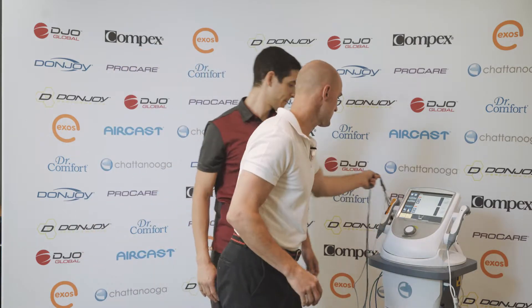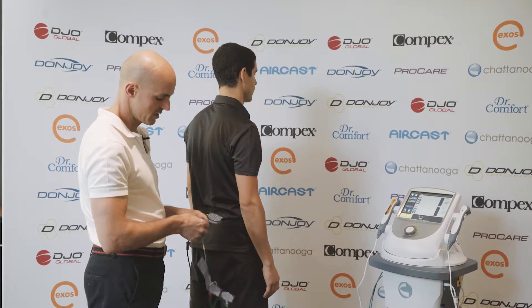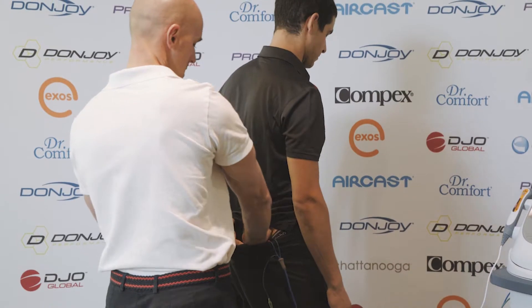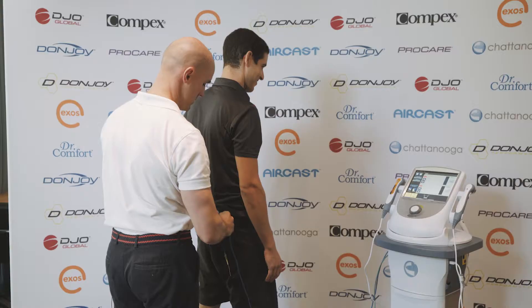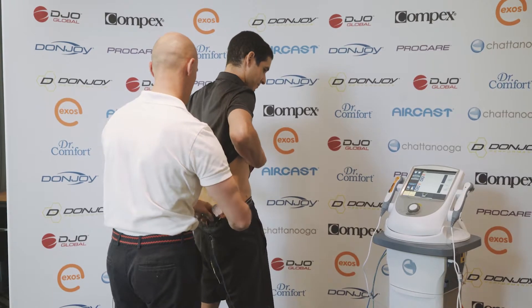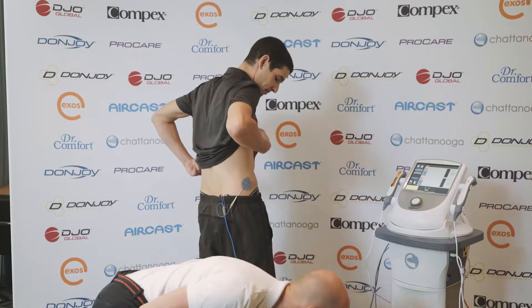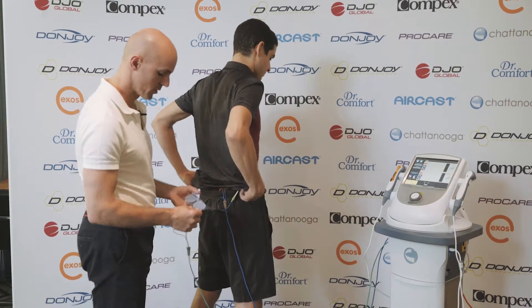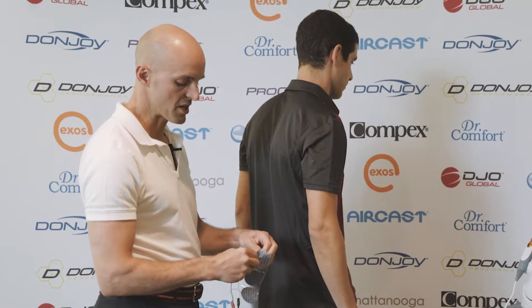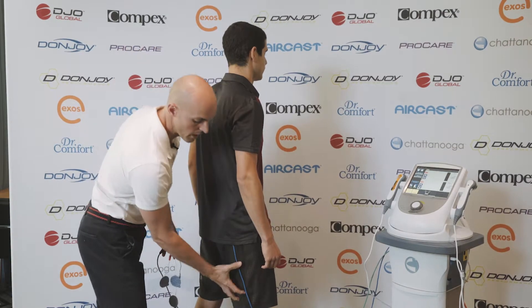We've got two channels here. We're going to stick one channel on his glutes and the other one's going to go on his hamstring. When we look at glute activation, it's not whether you're just using it or not — there's actually a ratio of activity that's ideal. When we look at a squat pattern, you should use the glute in a ratio of two to one.